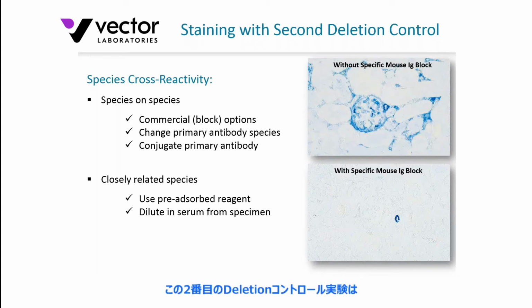So this second deletion control is certainly appropriate and pertinent to the immunofluorescent application as well in workflow. So these take-homes are good also for that application.